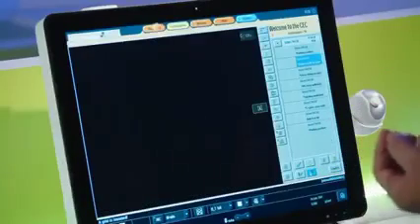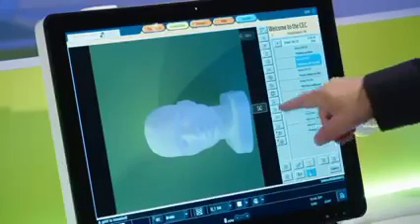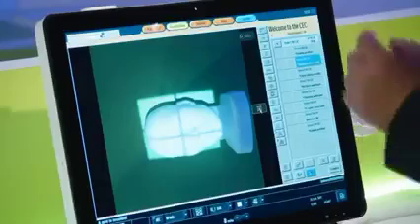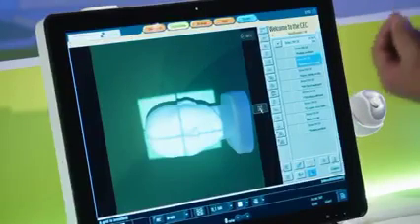If you would not have picked it up, because sometimes those movements are just a little bit, then you could release an X-ray where the region of interest is not in the central beam anymore, and you have to do a retake. Not anymore with the C90 and the camera functionality, because right now I can open the same camera as you have seen on the Eleva tube head, and I can open the collimator, and now I can see if the patient is still centered towards my exposure.